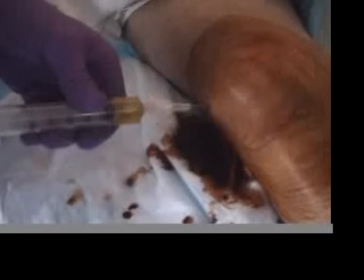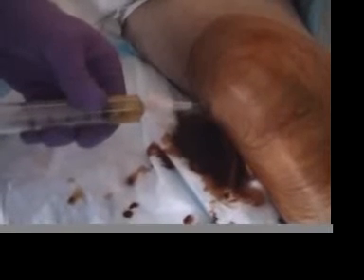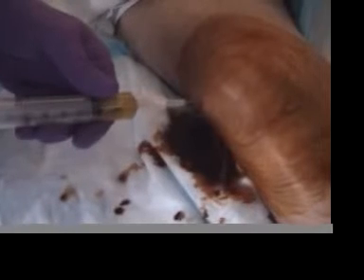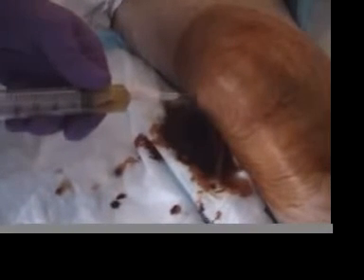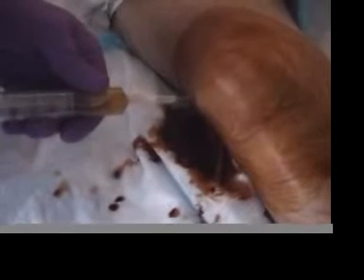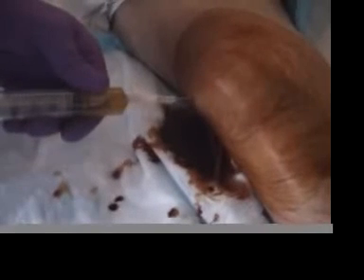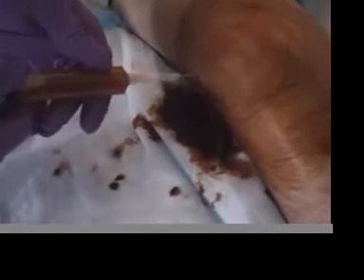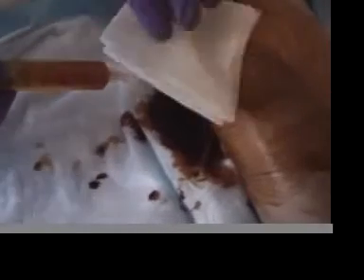You will need to send this for further studies. Remove the needle when you are done. Apply gauze to the area if there is any minor bleeding.